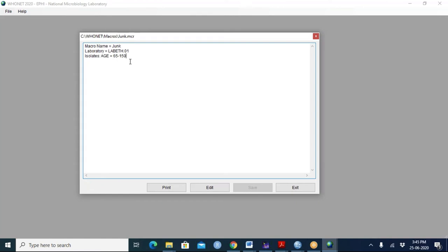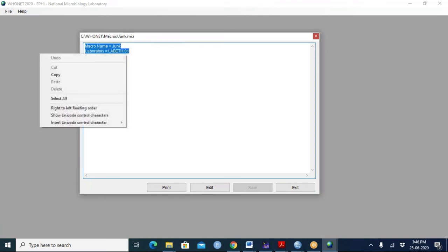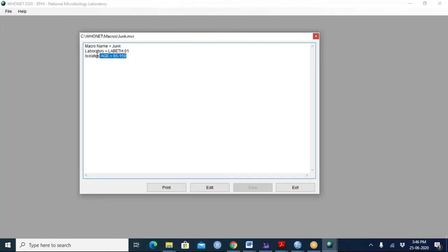Then what you can do is copy that row right now. Click on copy, highlight the row. No, the last row. Just the only row I'm interested in. Just highlight the last row. Click on copy. Good. You copied it, Control C or something? Great. Click on exit.